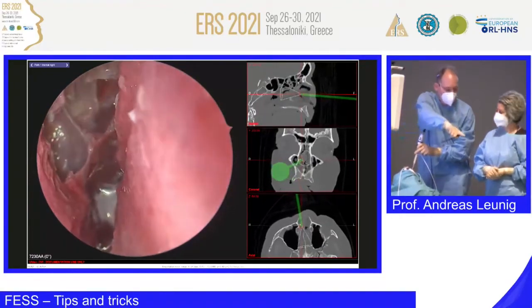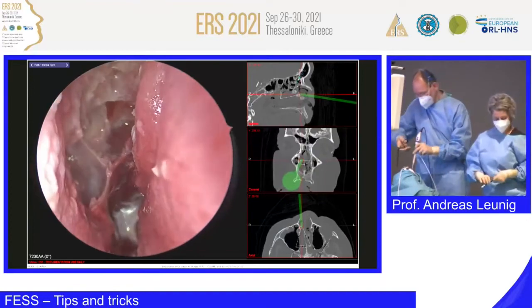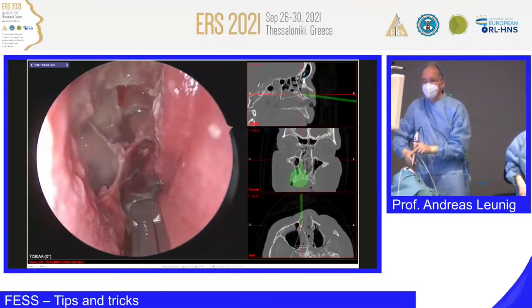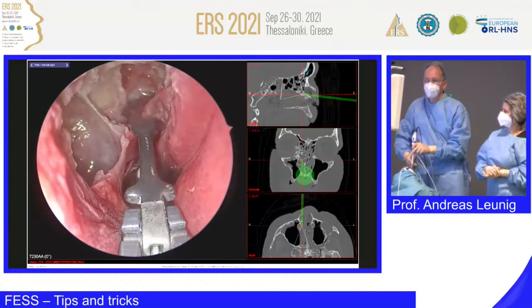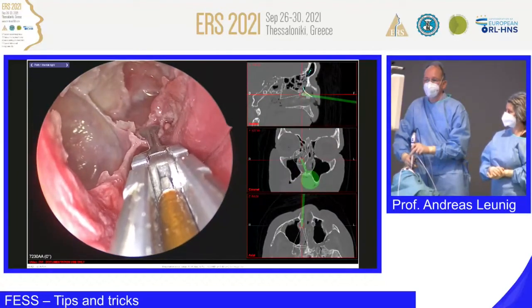The other one, give me the black ones. And there's another nice instrument which you should use in case you have a bleeding. You can go there, and if there's an artery, you make a bipolar coagulation, yeah?